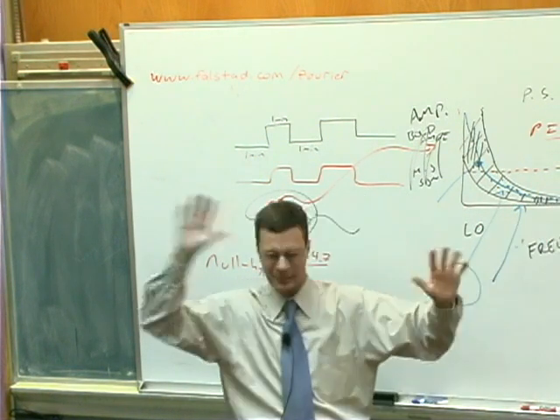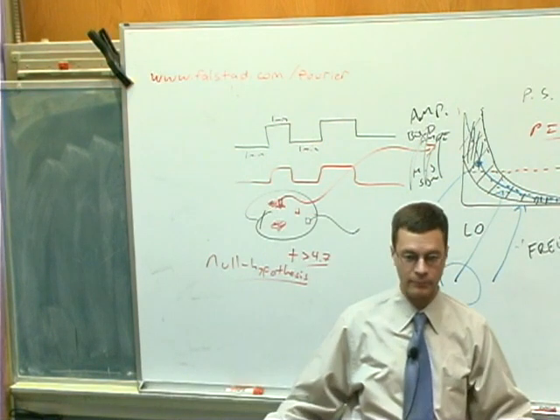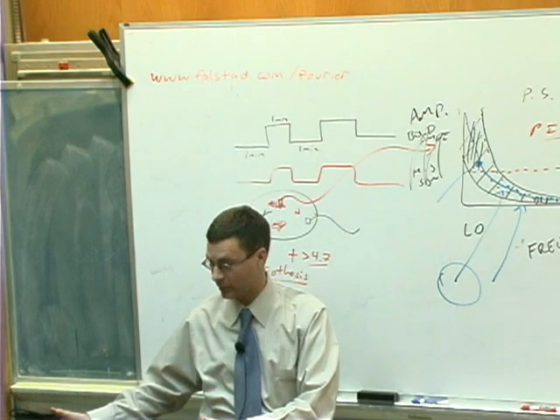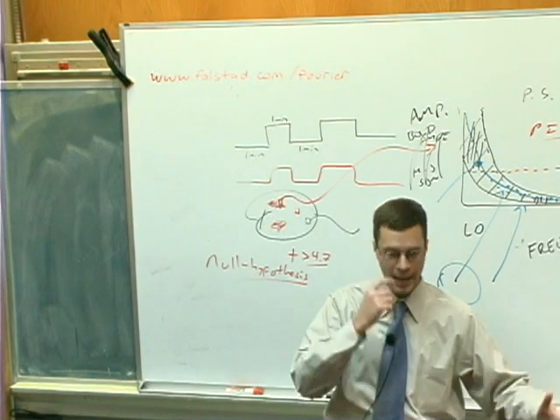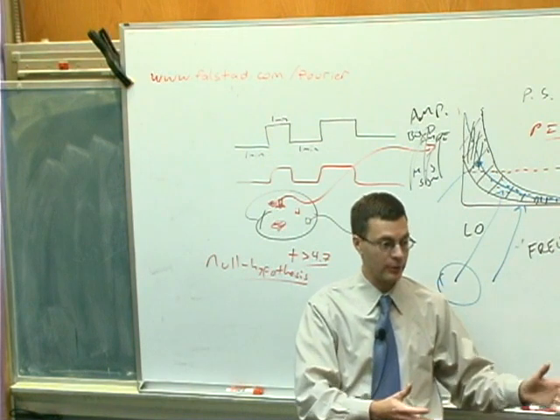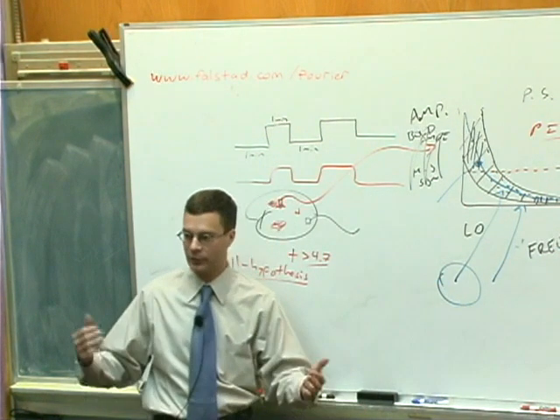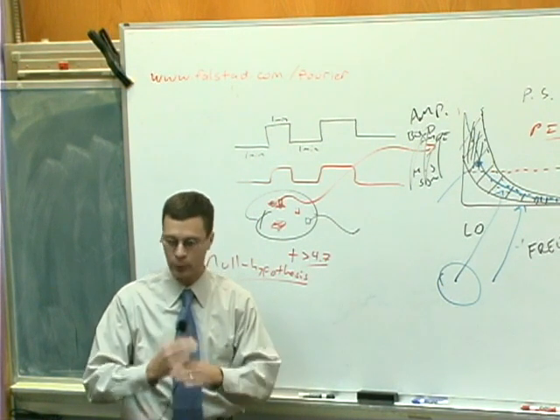But wait a minute. That's exactly the opposite of what I just told you with regard to the HRF, right? Remember, I told you that because of the filtering properties of the hemodynamic response function, you want an experiment that produces very slow changes in neuronal activity. And now, only 5 minutes, or perhaps 10, later, I'm telling you that because of the 1 over f noise function, you need experimental designs which have very high frequency alternations between them. Well, this would suggest perhaps that there exists a trade-off, and maybe even an optimum, between these two opposing forces, and that's indeed the case.